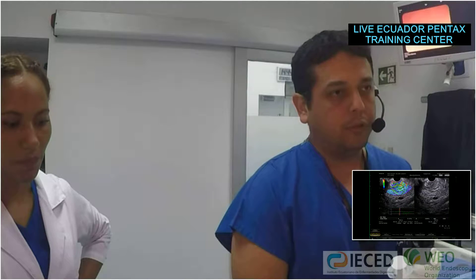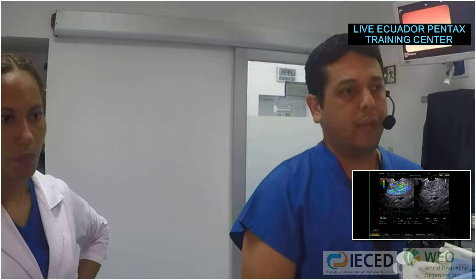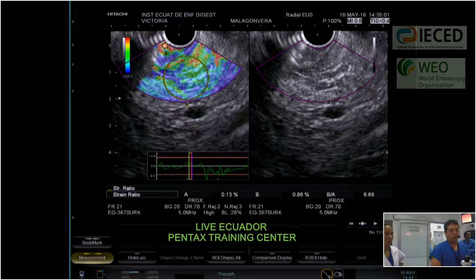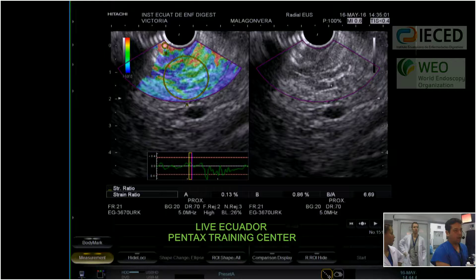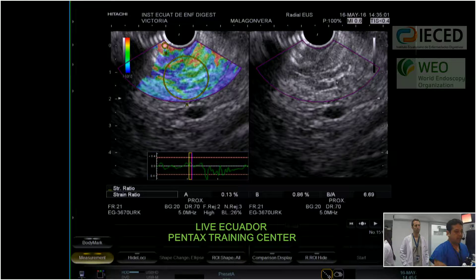We are now looking at the ultrasound image to see exactly what happened with this patient. We are looking at the head of the pancreas, and as you can see here in the image, the head of the pancreas shows some hyperechoic areas — small areas with a suspicion of fibrotic changes.